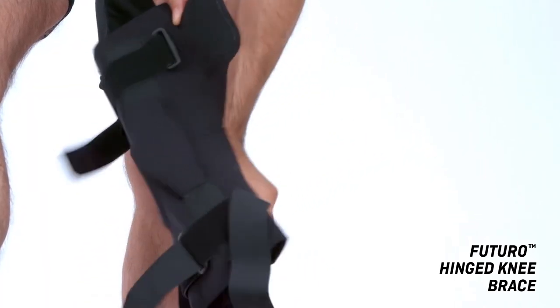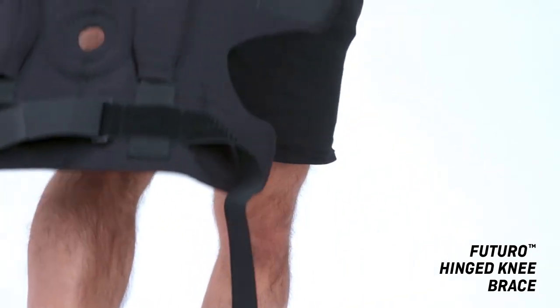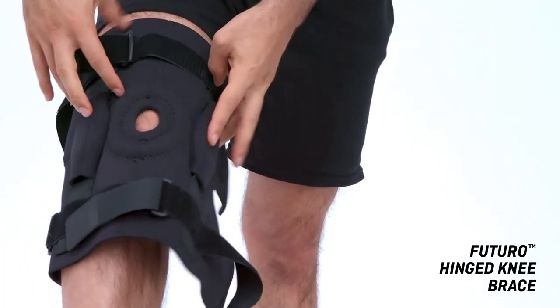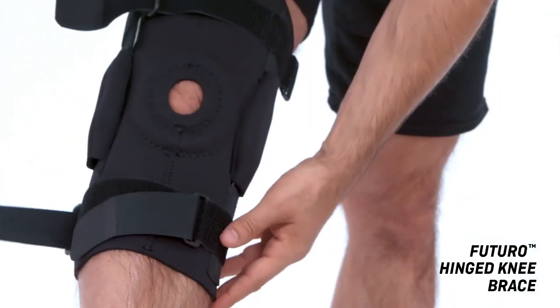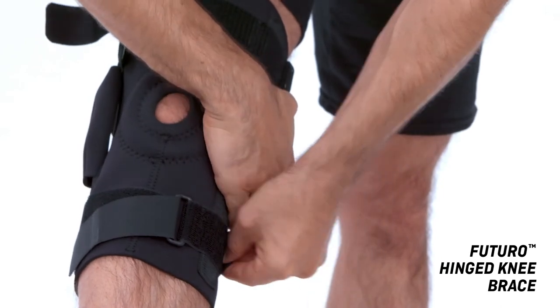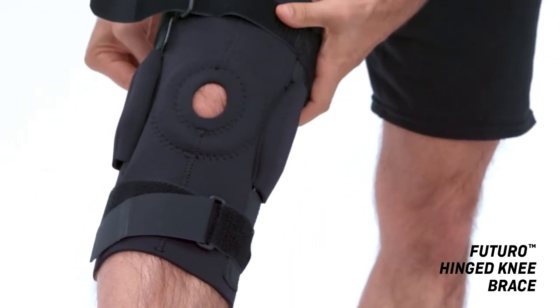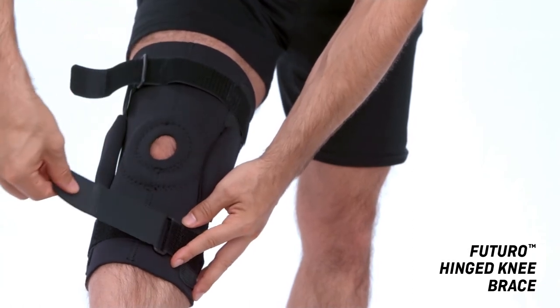Place the widest edge of the brace along the thigh while positioning the patella ring over the kneecap. Secure the bottom closure of the brace below the back of the knee, then secure the top closure. Loop back cinch straps through buckles and tighten.